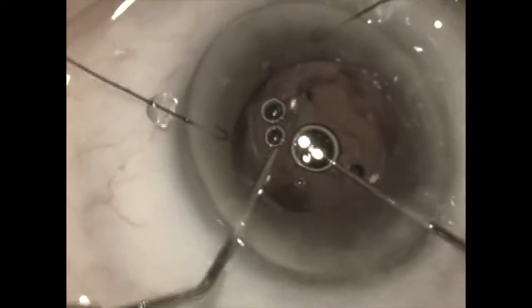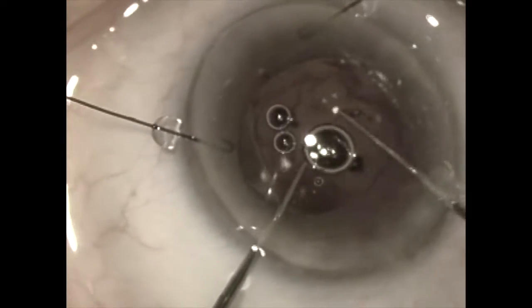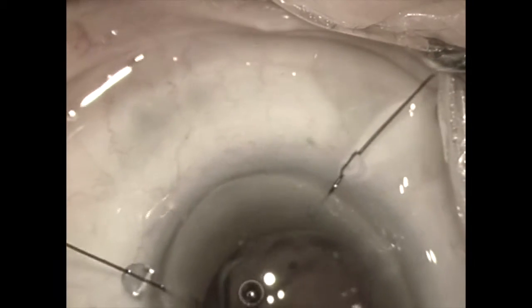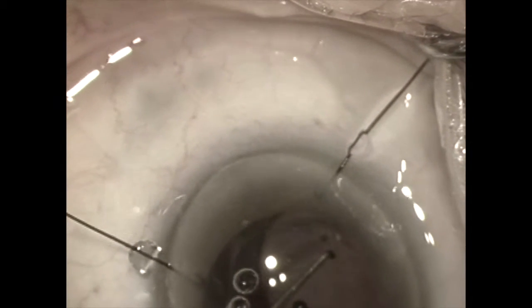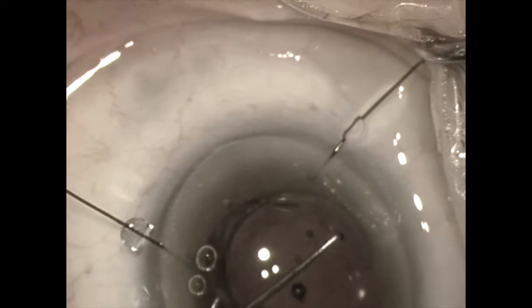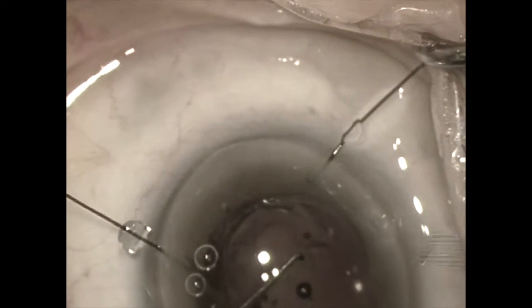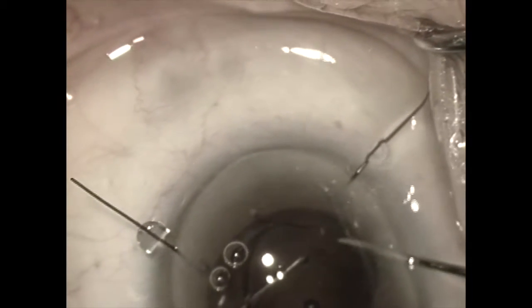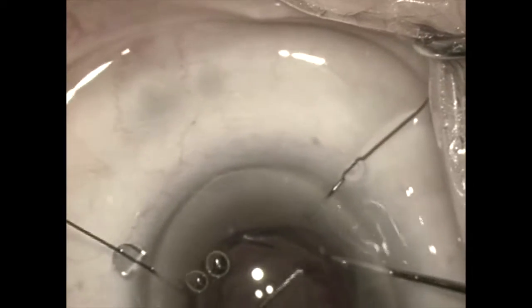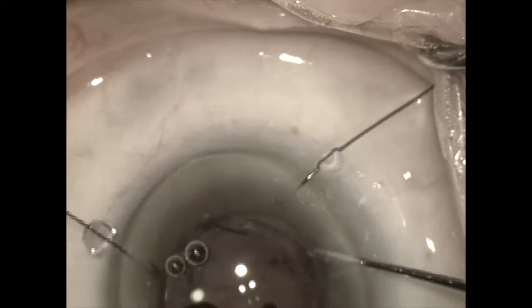Once the lens is completely within the capsular bag, we are going to go ahead and reverse optic capture it. I am going to reach under the inferior portion of the lens and bring it up over the anterior capsule rim, and once that is done I can reach over to the other side and bring the other side up over the anterior capsule rim as well.